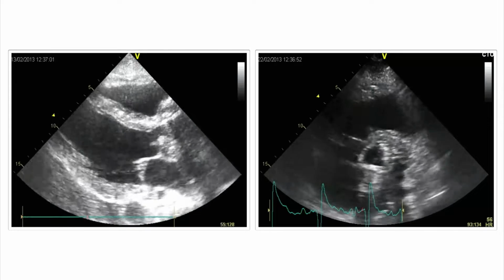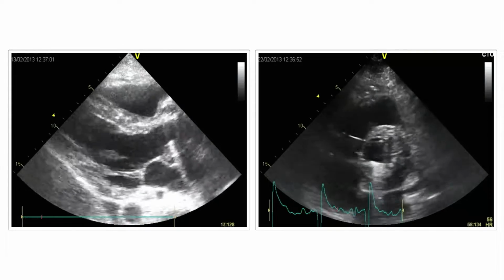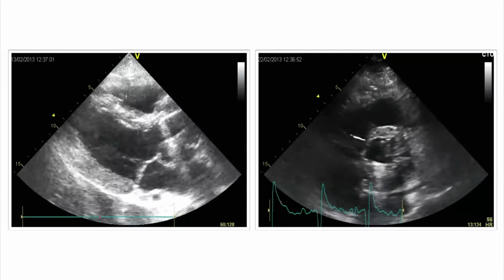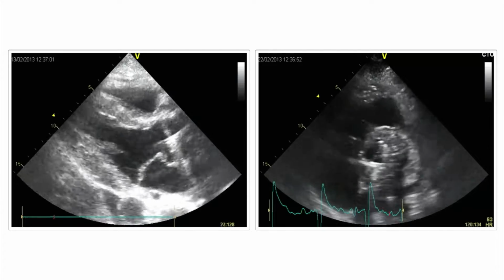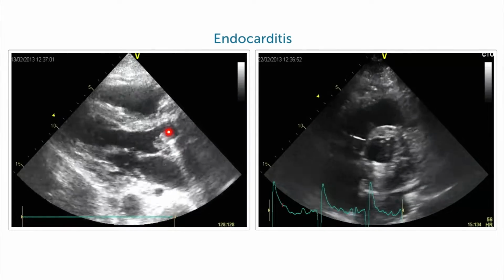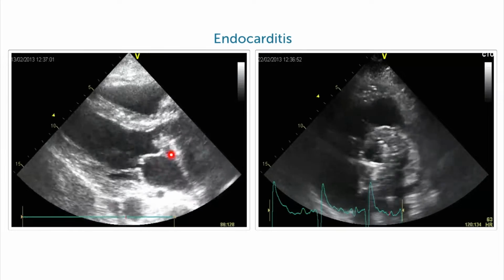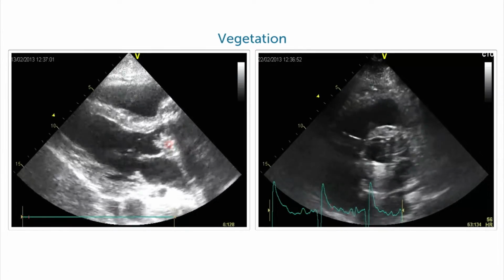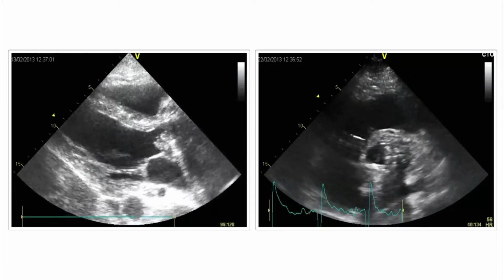This was the cause of the stroke, and I guess you can understand something is wrong with the prosthesis in the aortic position. Yes, that's completely correct. If you put all of this information together, the patient has an endocarditis of the prosthetic valve. You see a structure here, which we call vegetation, a mobile structure, and part of it has probably dislodged and caused the stroke.